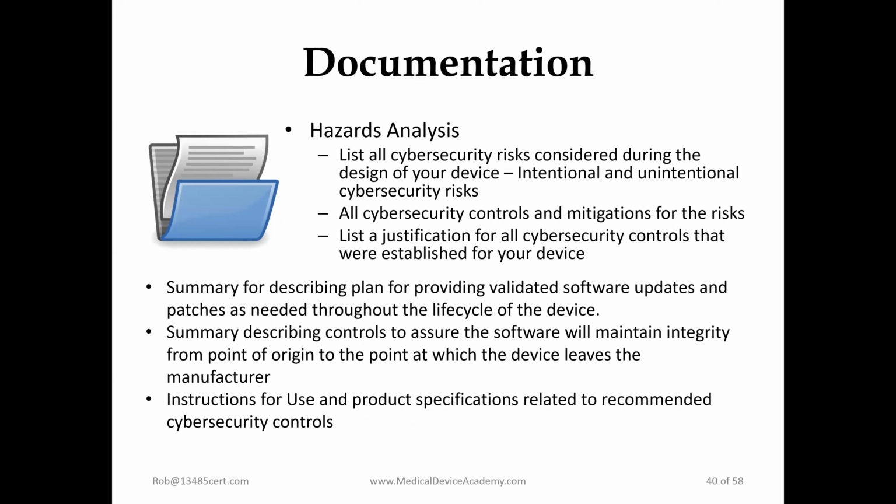A summary plan for providing the validated software updates and patches needed throughout the lifecycle of the device, and any controls that are needed so that the software can maintain integrity during transport or communication from one point to another. And then finally, if there are any cybersecurity controls in the instructions for use, they want you to identify that as well. Next slide.